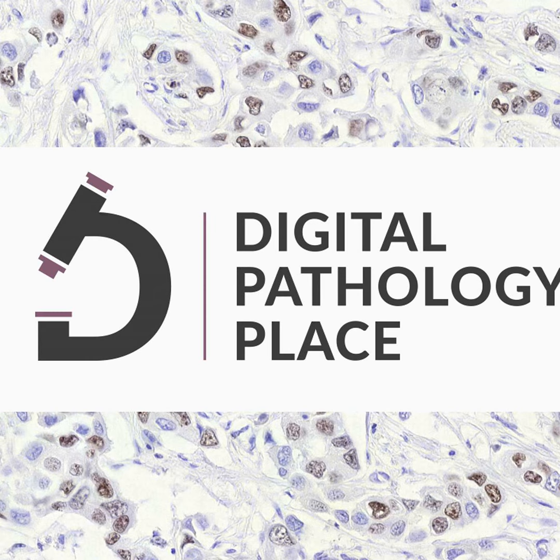So you can skip the PCR. When the score was very low, the likelihood of this mutation being there was very low. So you can skip the PCR. And then if the score was in the middle, go do the PCR and confirm. So in 43% of the cases, the scores were high enough or low enough compared to the threshold. And the threshold was set in a way that kind of mimicked the clinical workflow. So that's how they have proven the real world clinical utility of this computational pathology biomarker.